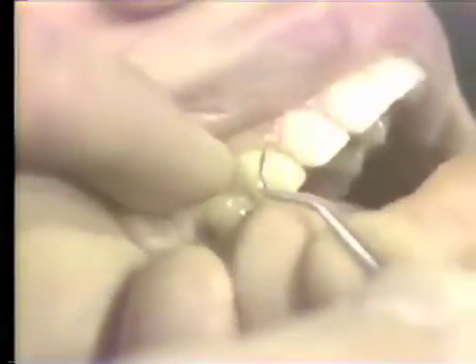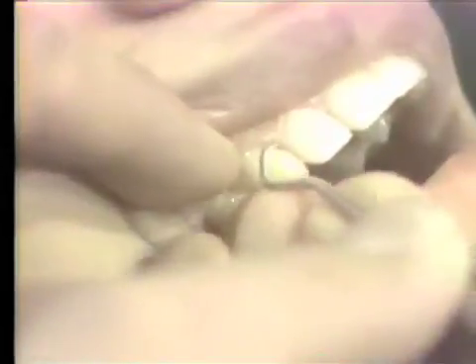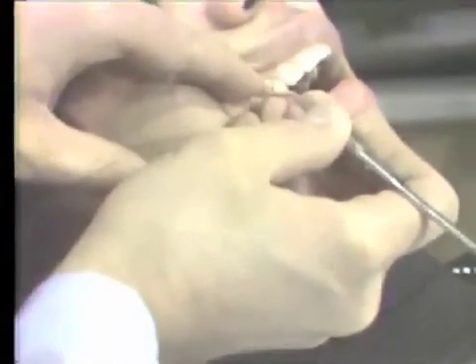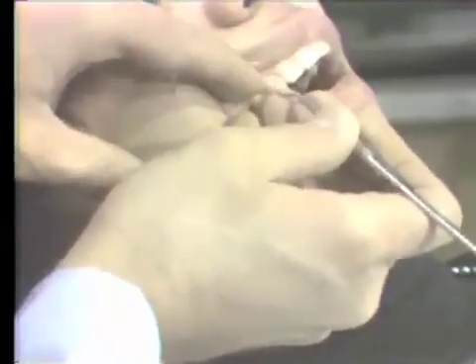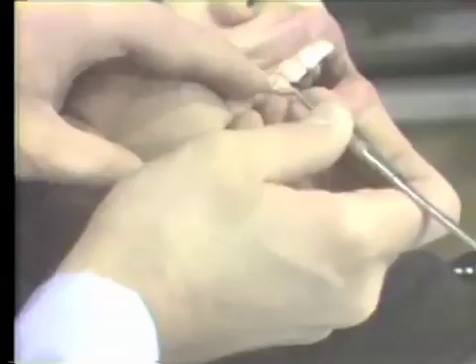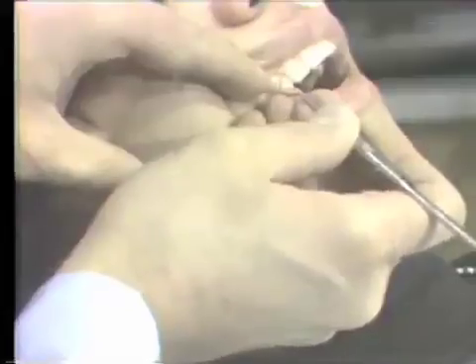When the piece of calculus is engaged, there is a unity of motion between the hand and the wrist with very little finger movement in the whole stroke. Finger movement alone is avoided because such a stroke tends to tire the fingers very rapidly. The short, firm stroke is used to remove calculus, being sure to dislodge the entire deposit rather than planing over the surface of it.